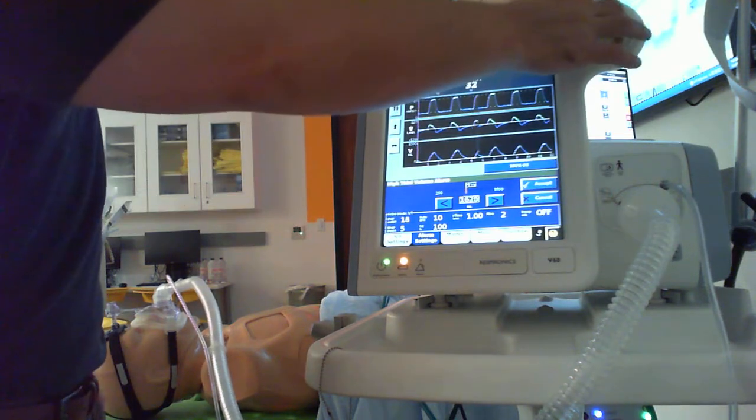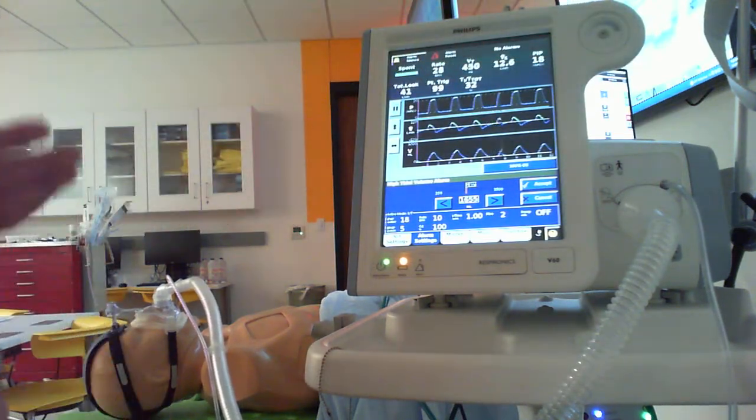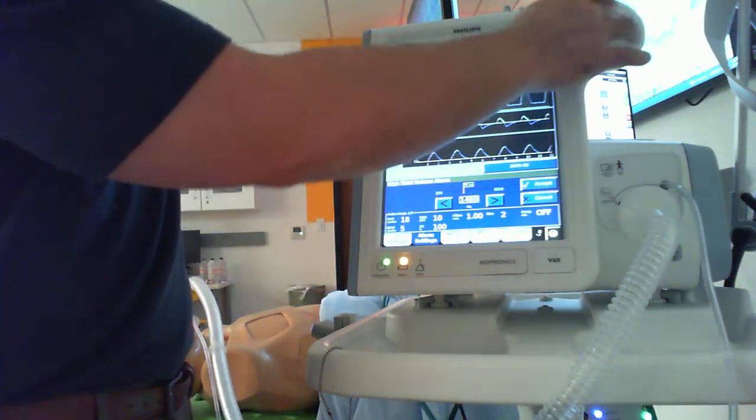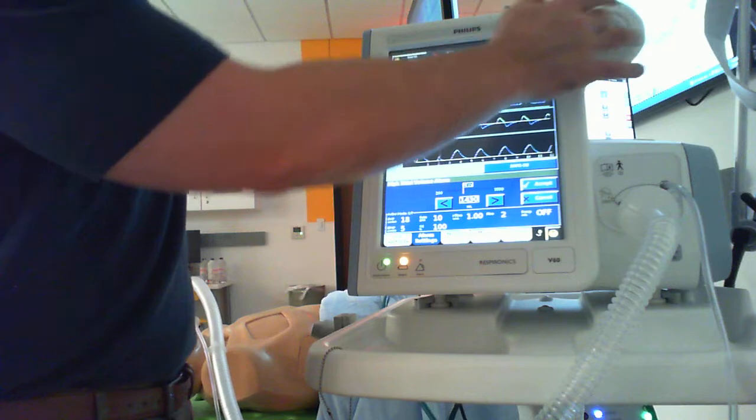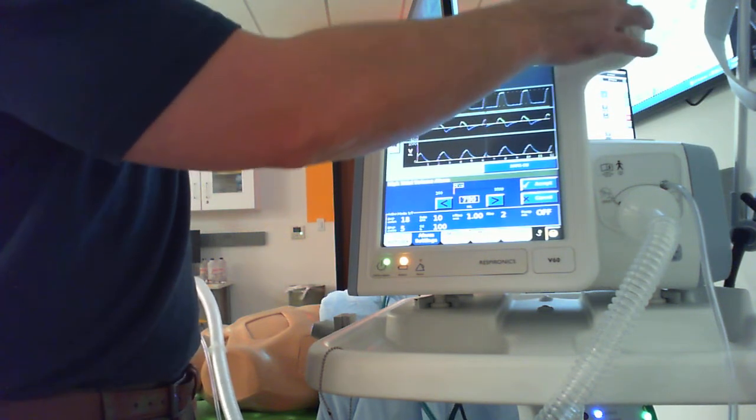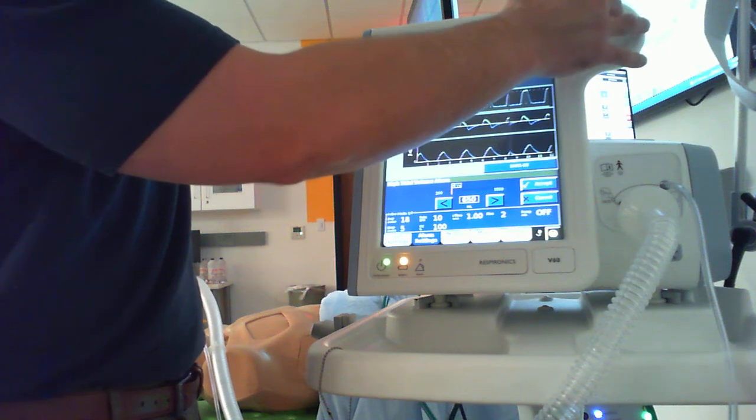I like to know if my patient's getting huge volumes, okay? So when I'm adjusting this, you could set this maybe anywhere 150 to 300 mils above your current target. So let's go 200 mils above. So I'll set this at 650, okay?